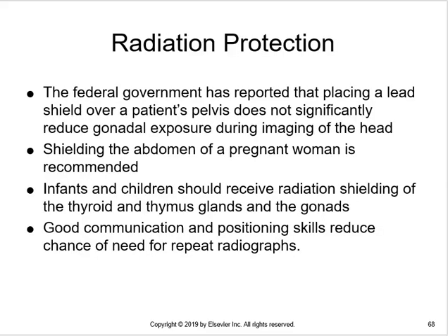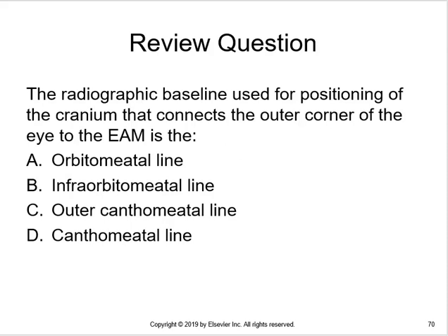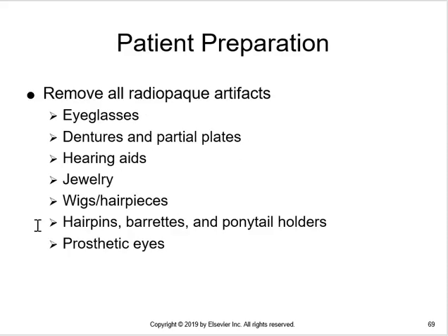Radiation protection, for the most part, is going to be your collimation, but we do have some specific positioning that we're going to use to reduce radiation dose to the eyes. Also, it's a good idea to put a lead apron on a patient if it's not going to interfere with the exam. So make sure you lead up the patient.